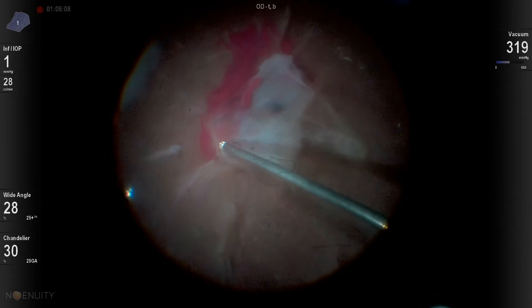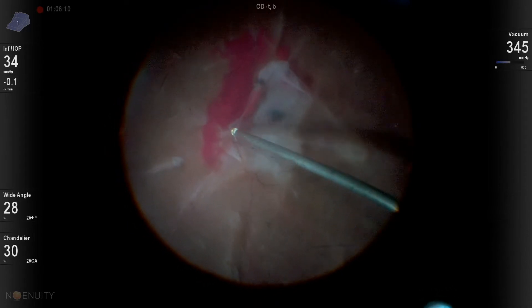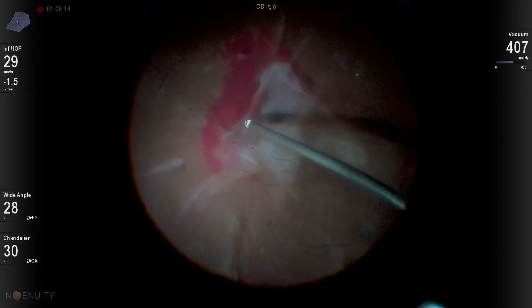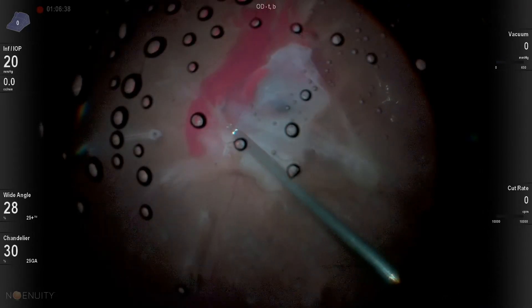I try to leave any hemorrhage alone — I don't want to stir that up in the eye. But if I do disturb it, I try to stay right on it and get it all out of there so I maintain good visualization.